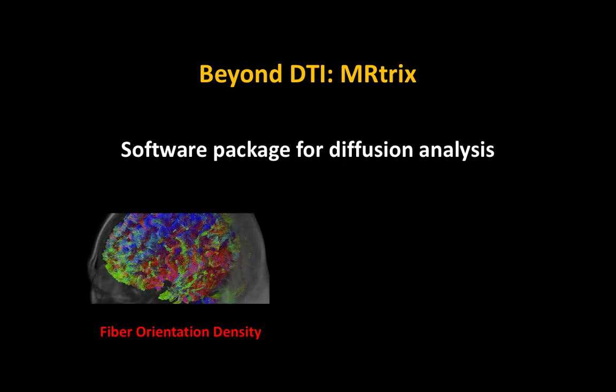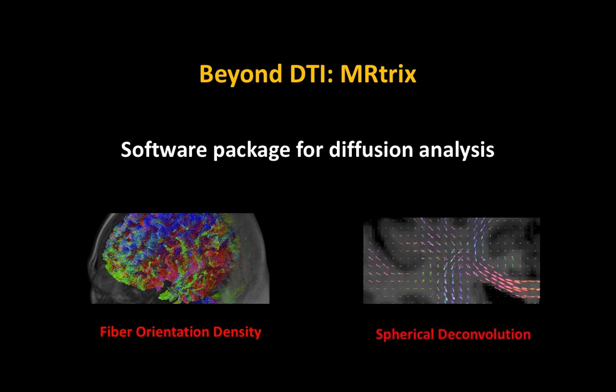This looks similar to those tensors that I showed you before, but there's a critical difference, which I'll show you in a couple of slides. I'm going to break out in a little bit and show you a demo of a few basic commands that MRtrix uses to show you how we're doing all of this. But a few more words about MRtrix.